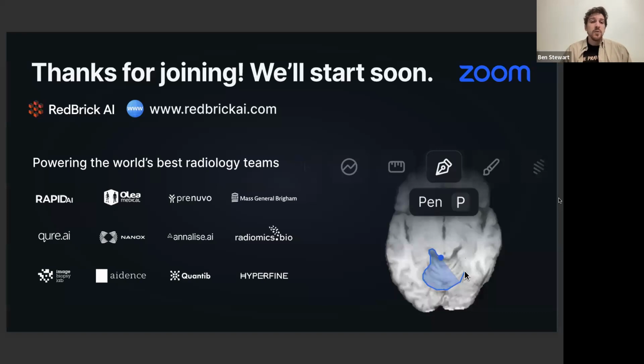Regarding compliance, we are HIPAA compliant, we are GDPR compliant, we are SOC 2 Type 1 compliant, and privacy by design is built into our app at every single level, particularly in the way that we handle the storage of images and volumes. I'll give you a hint. We prefer to integrate storage methods into our platform, which is why the vast majority of our customers are taking advantage of our native integrations with Amazon S3, Google Cloud Storage, and Microsoft Azure.